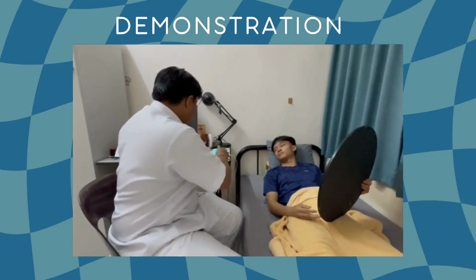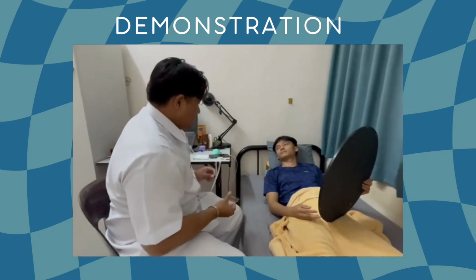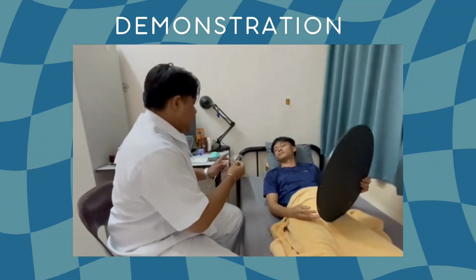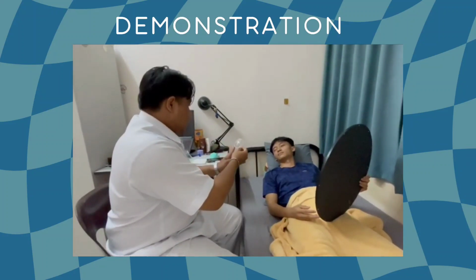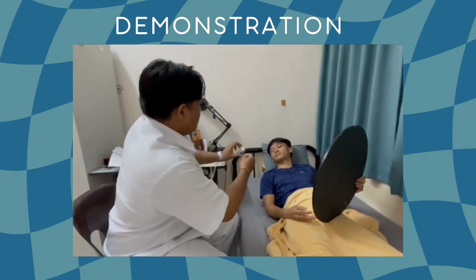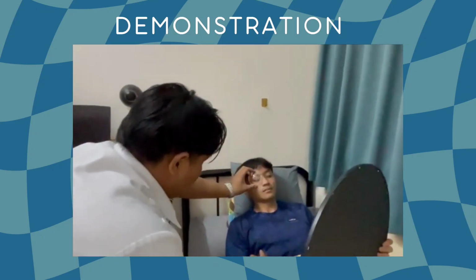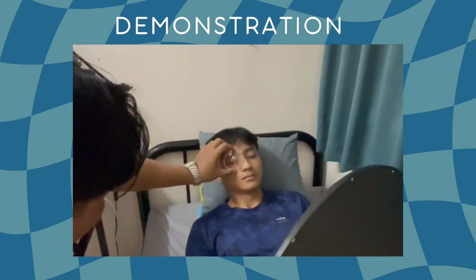Right. So how is the placement for the eye shield? The tip will be on your forehead and the round one will be on your cheek. So you may look in the mirror. This is how your eye shield placement will be.